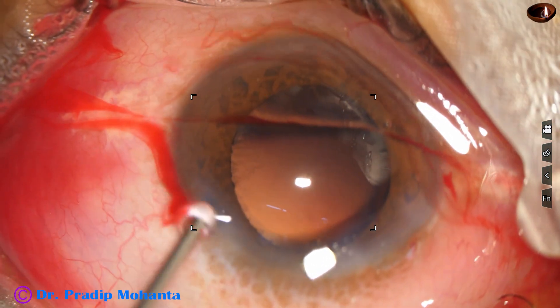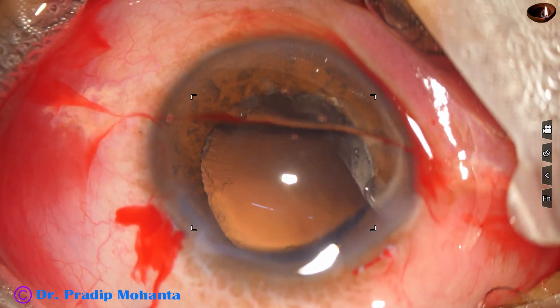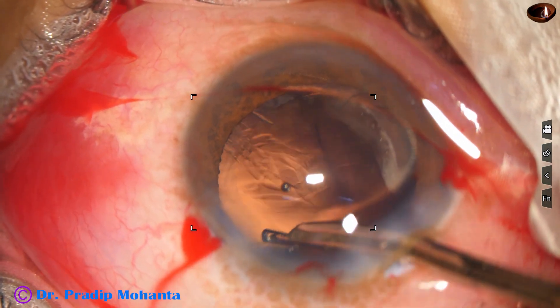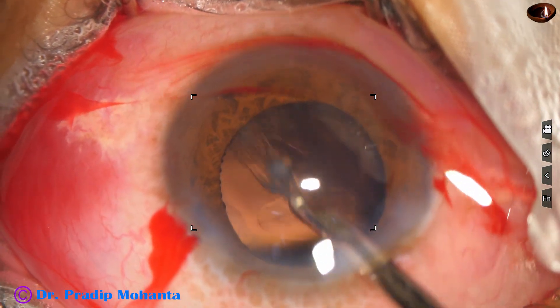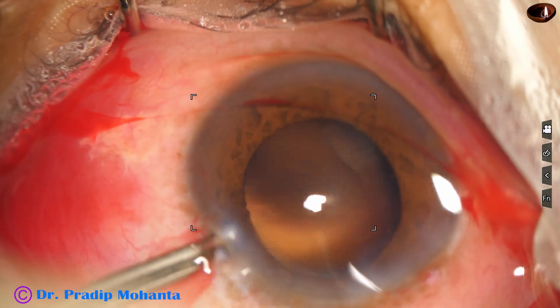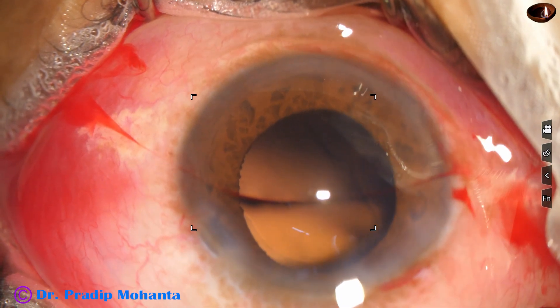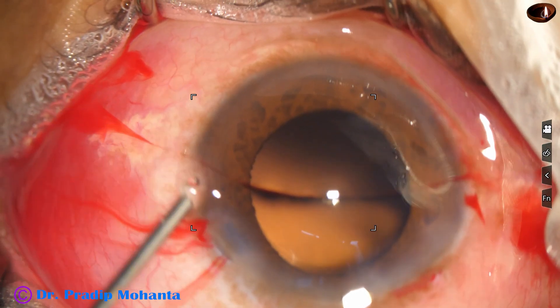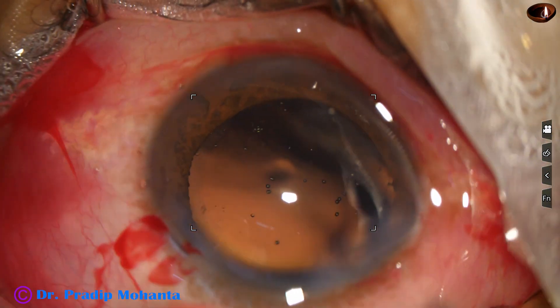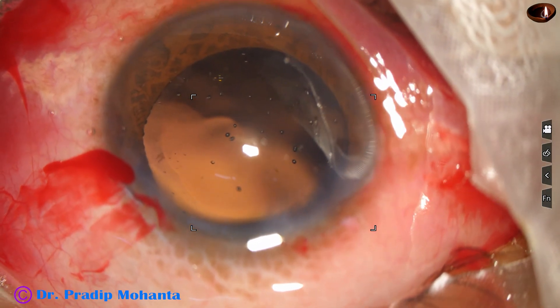There is a thread of blood clot over the cornea; we have to remove that. The cortex is being removed by a 23-gauge Simcoe cannula. Whatever instrument you practice more, that instrument becomes your friend. I find it very easy to remove the cortex with this 23-gauge Simcoe. If you get used to coaxial IA, coaxial IA will be your best friend; if you use bimanual, bimanual will be your best friend. Every surgeon has his own comfort level — follow that. In these matters, do not follow other surgeons.